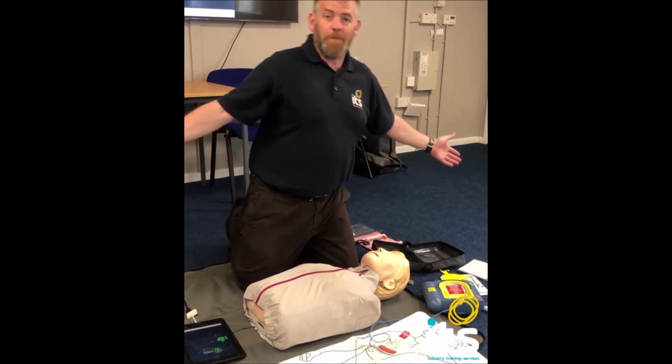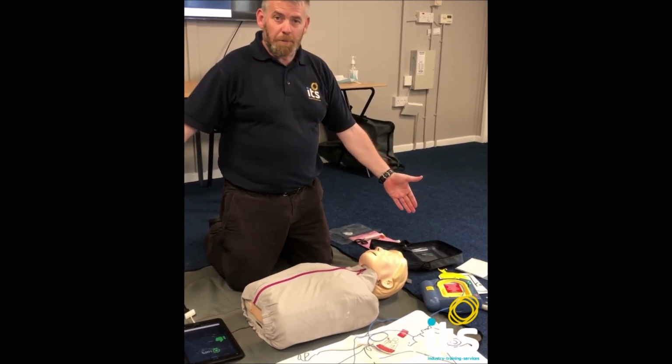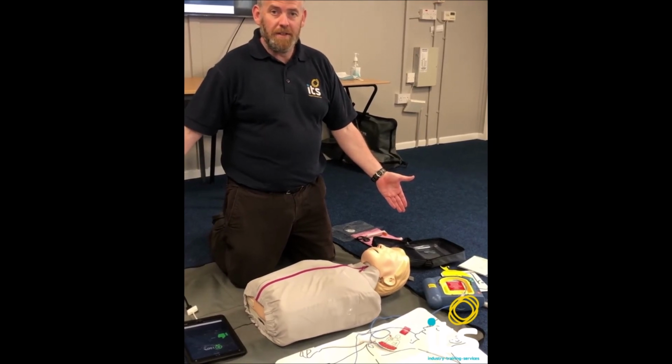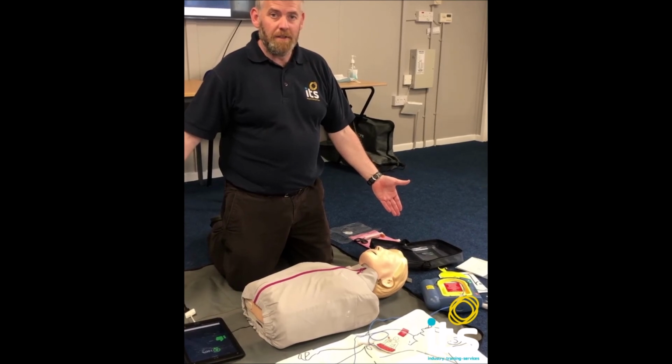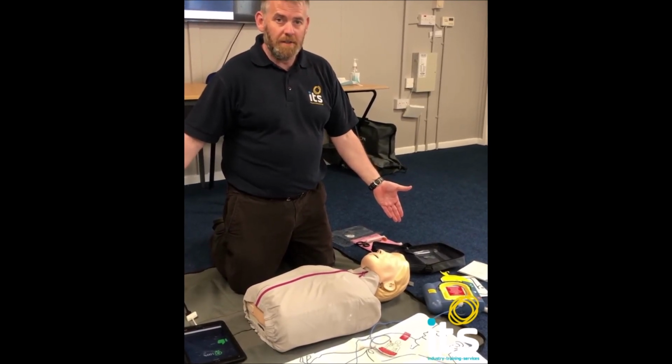Stop CPR. CPR stopped. No one should touch the patient. The machine is analysing. Analysing. Shock not advised. It is safe to touch the patient.